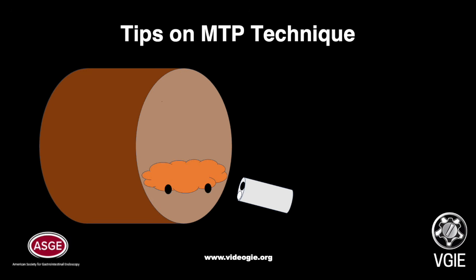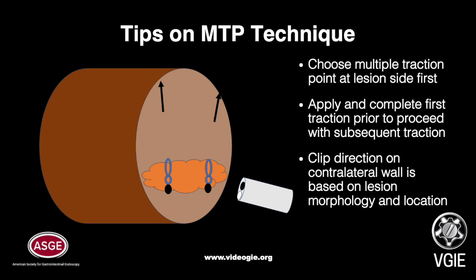First, choosing a correct traction point at the lesion site. Placement of traction at each point should be completed before moving to the second point. Careful attention should be made for the contralateral wall clips. This can be placed immediately on the contralateral wall, distal towards the anal side, or proximal towards the oral side. Therefore, 3 key points should be considered: choosing the correct traction points, applying the first traction before moving to the subsequent one, and clip direction on the contralateral side based on lesion morphology and location.